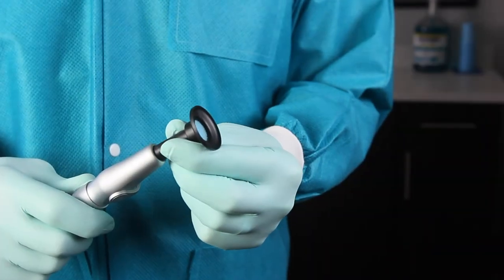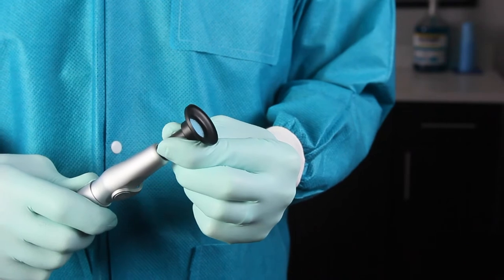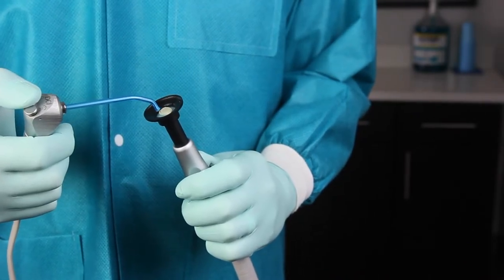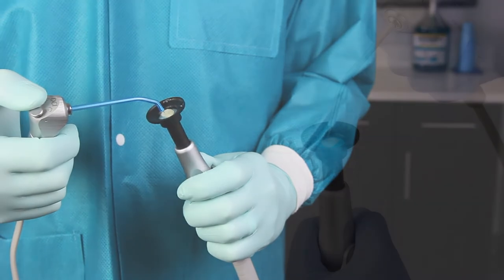The VacuGrip connects to any HVE valve and uses high-speed suction to hold small indirect restorations securely, nearly eliminating the risk of dropping or damaging them.